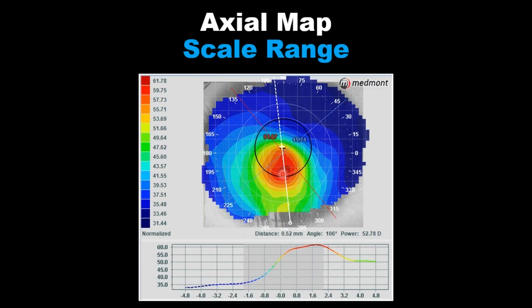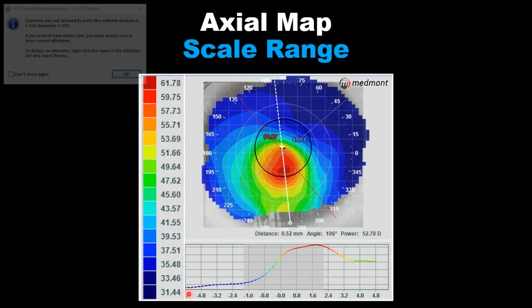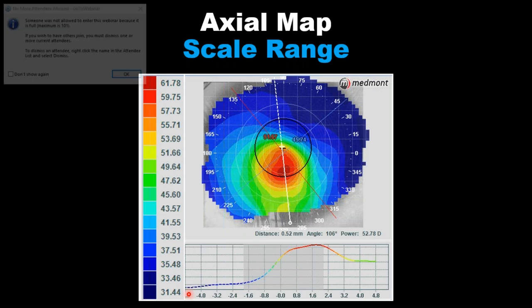Another way we could look at this eye is the distribution of power across the entire eye. Looking at the scale on the left side, this eye has power distributed from 31 diopters as the flattest up to 61 diopters as the steepest — a 30-diopter distribution of power across the eye. Podemos verificar la escala: desde 61.78 el punto más curvo hasta 31.44 el punto más plano — básicamente 30 dioptrias de diferencia corriendo de un lado a otro en esa córnea, lo cual obviamente no es normal.